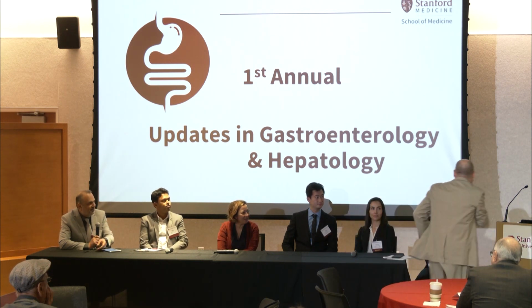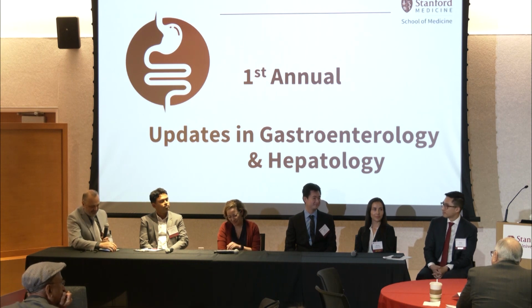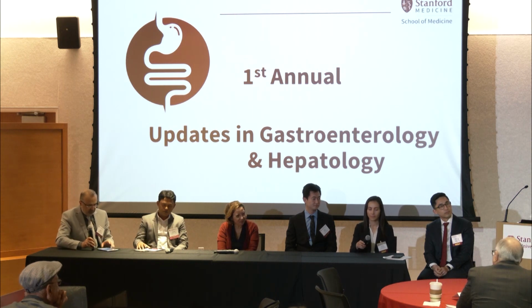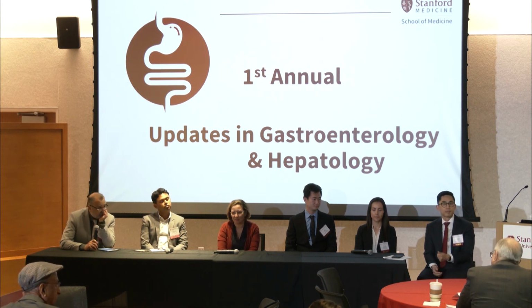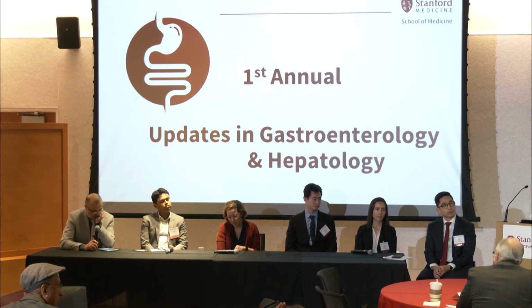I'll push a little more on the G-POEM gastroparesis question. There are some centers who are now going directly to G-POEM with a gastroparesis 4-hour study. And the argument that's being made is that safety is pretty good. 70% response rate, at least in the first year, looks pretty good. We don't have any meds right now that are FDA approved besides Reglan. Tons of downsides with it. We know medical therapy doesn't work well.